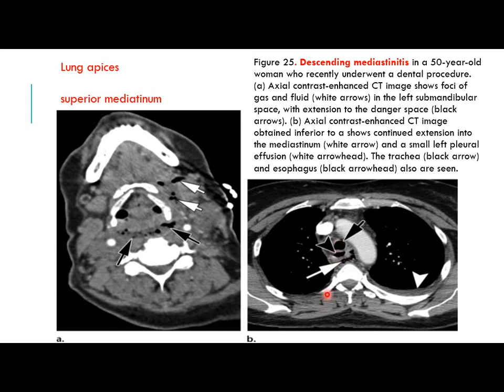So this is a case of descending mediastinitis due to a dental procedure that had led to the infection and inflammation of the submandibular region.